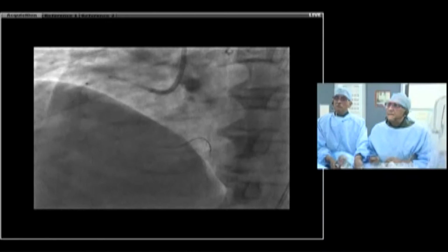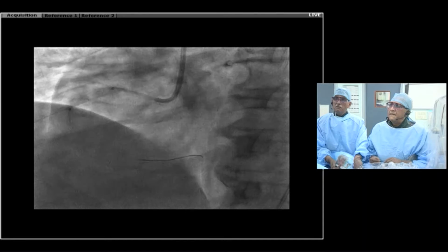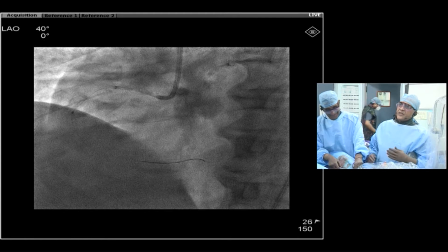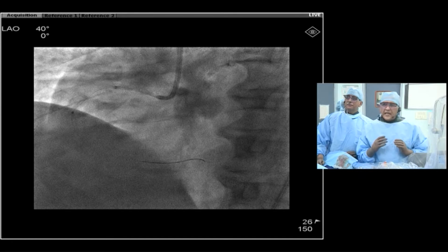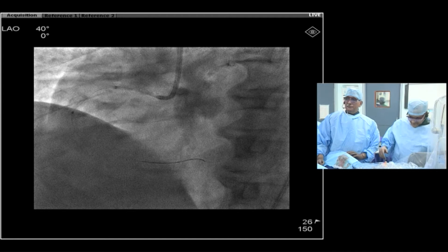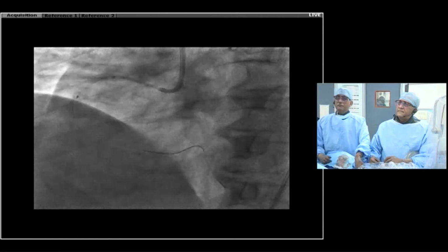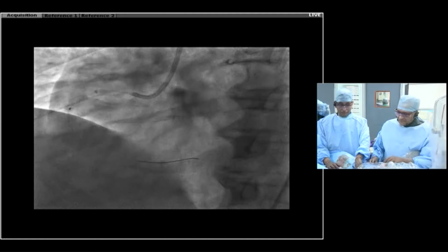So Kirti, since you're not injecting dye much, how do you sense that there's a perf in this vessel? Yeah, that's a good question. There'll be chest pain, there'll be a drop in pressure, there'll be a change in hemodynamics. I just don't use any contrast at all because it doesn't help. I got a good pressure. I'm okay. And as long as we use only saline and we have a Guidezilla, I think we're okay. The problem happens when we have contrast. Yeah, I would highly recommend against using contrast unless you're in stent. And even then, with Shockwave now, the use of laser with contrast, for us at least, has gone way down. It's just a super uncontrolled way of causing a burst in the vessel.